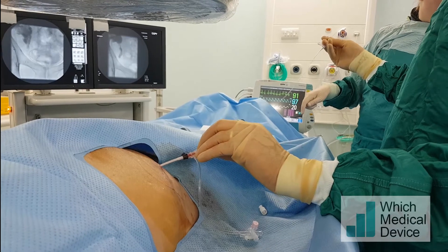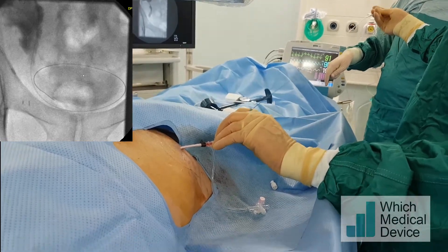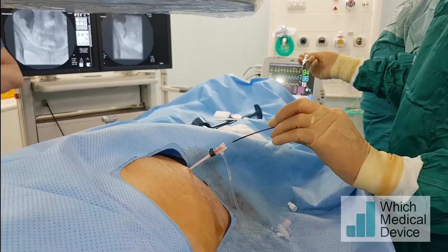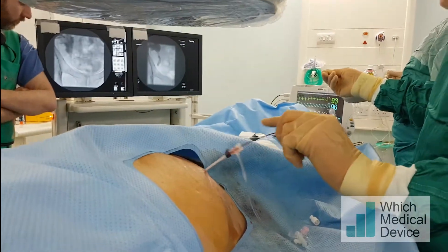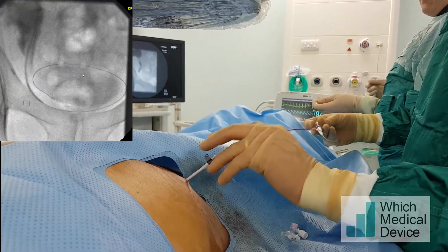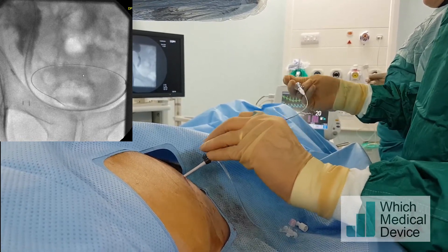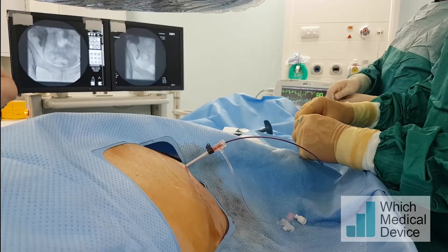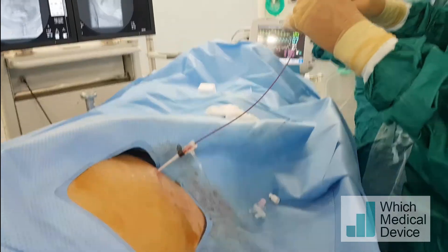Now we're removing the angioplasty balloon over the 018 wire and I'm going to try to get a 5 French catheter back in over that wire, now that we've dilated it, to allow us to place an 035 guide wire. Just reinserting the 5 French catheter over the 018 wire — it is tight, but with some back-tension on the guide wire it has gone into the bladder. We can now change for an 035 Amplatz super stiff guide wire, which will give us enough support to place a stent.